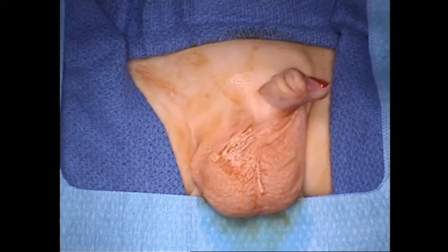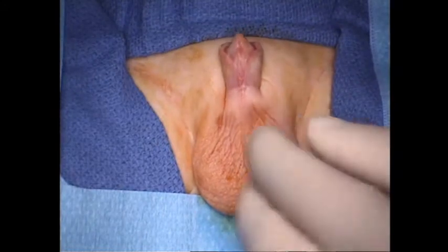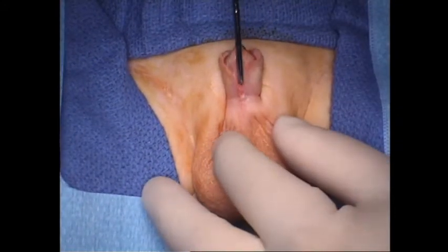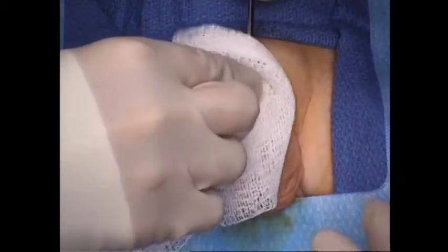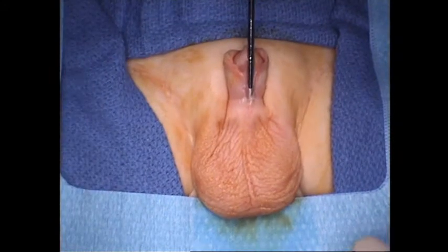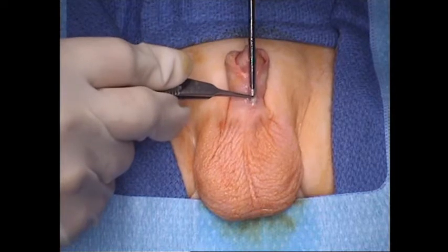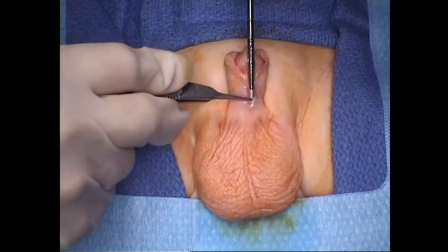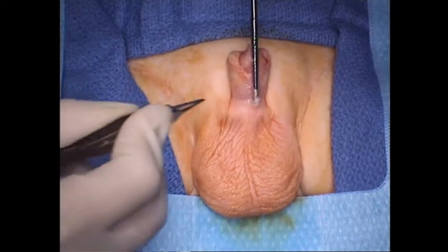Now we're placing a 5-0 Prolene through the glans for our retraction suture. And we start these proximal cases by placing just an 8-French straight sound through the urethra so that we can see what the overlying coverage is. And so we can see that from here to here, it's so thin that there's no way we could separate the skin right here from the underlying tissues of the urethral plate and urethra.